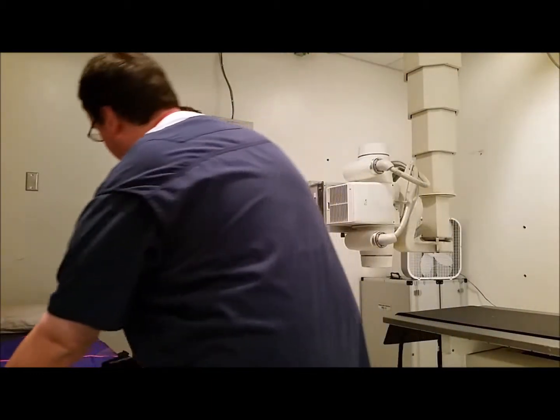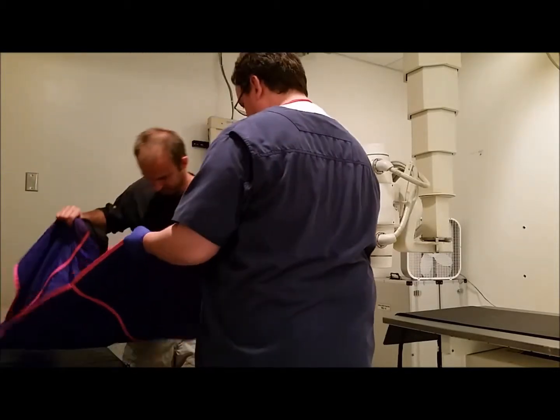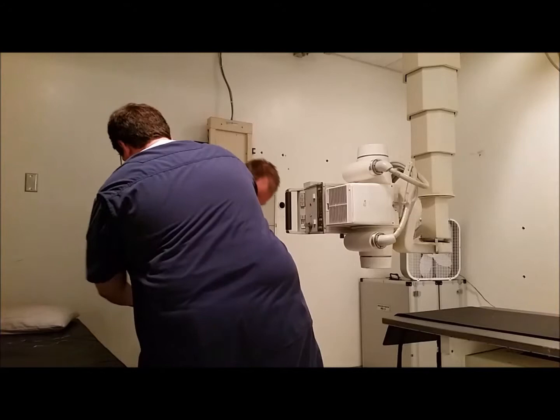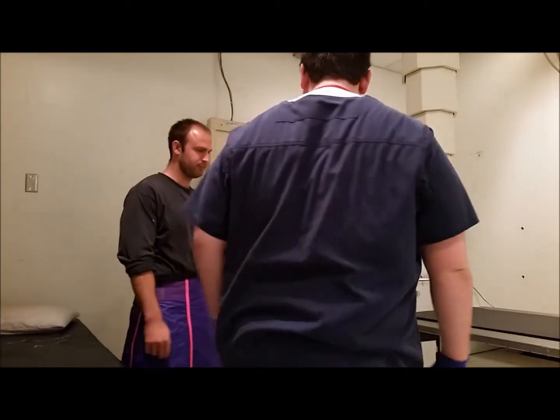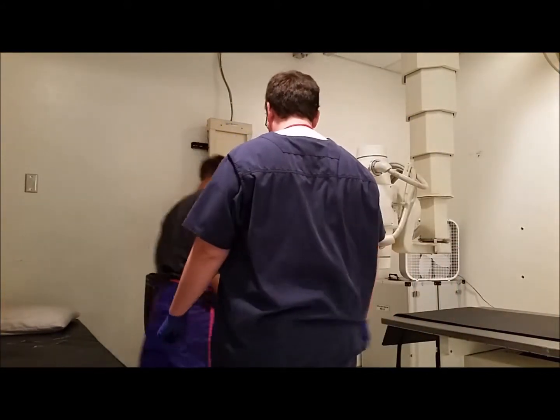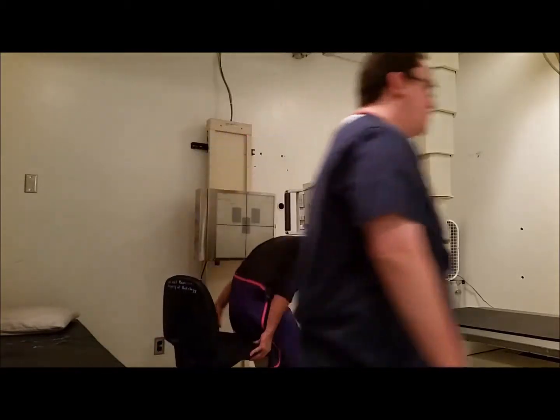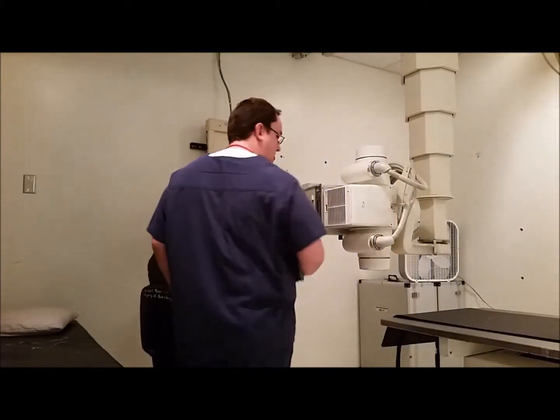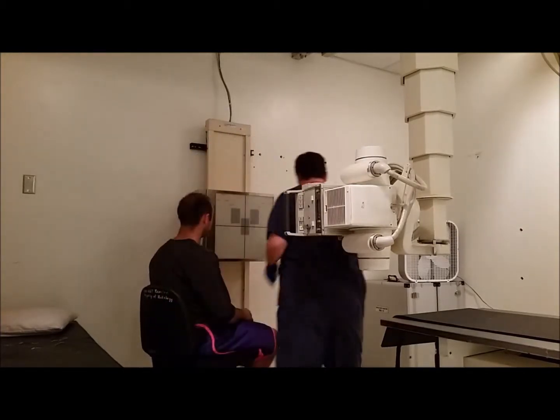We'll start by putting some lead on you here. Wrap that around you so you're nice and protected there. Alrighty, have you sit down in the chair. Load up our Bucky here. We're going to be doing an 8x10 for all of our images.